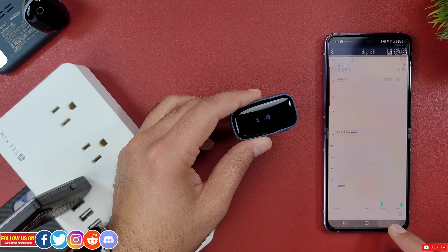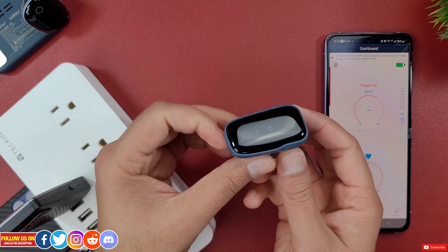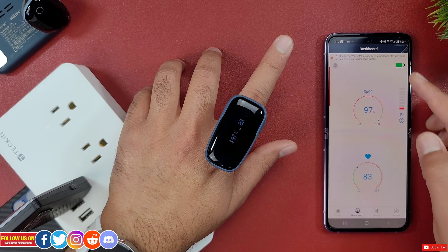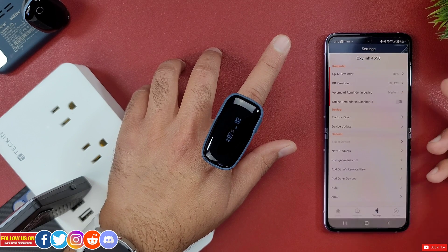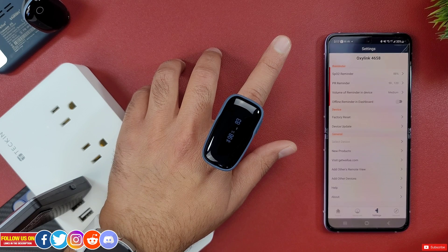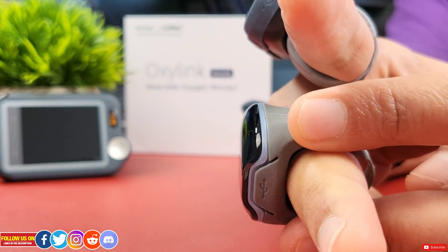At the bottom you'll get the motion graph — I was surprised to see that I move quite a lot during sleep. Going back to the bottom tab, the dashboard shows all real-time data. Under settings you can set the upper and lower limits for notifications with respect to SpO2 and heart rate.